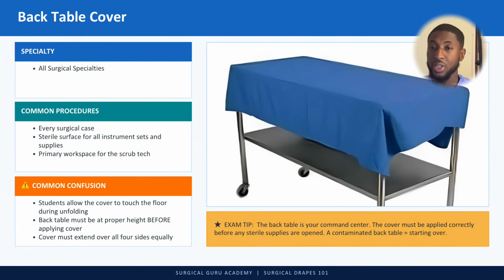So this is used in all specialties, every surgical case. Your back table cover opens sterilely. Usually grab from below the table edge to open it up. That way your hand never touches the top. You touch the very edges that are going to be under the surface of the table. That way the top of the table will stay sterile.